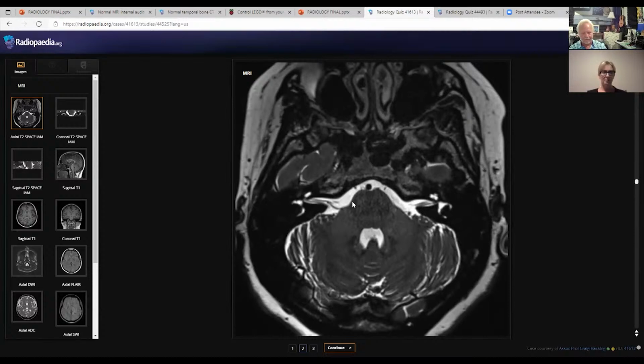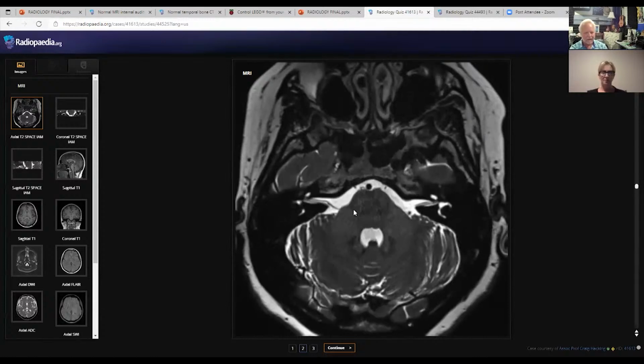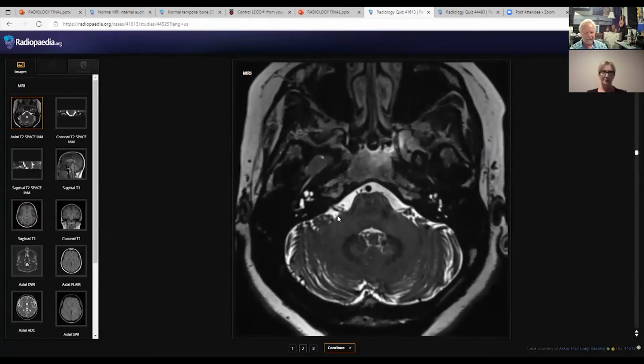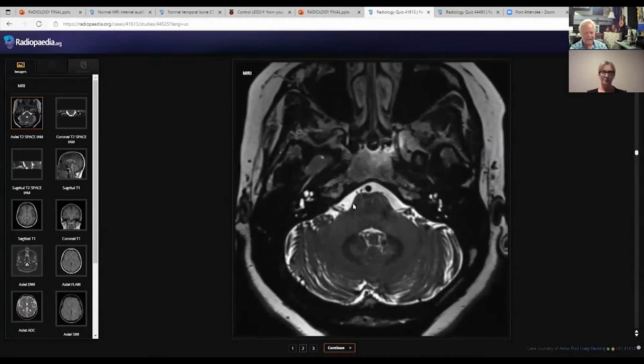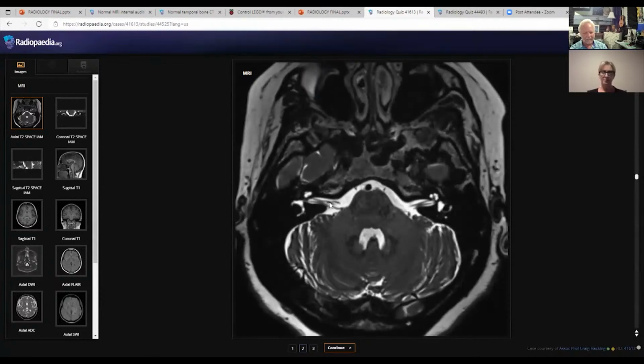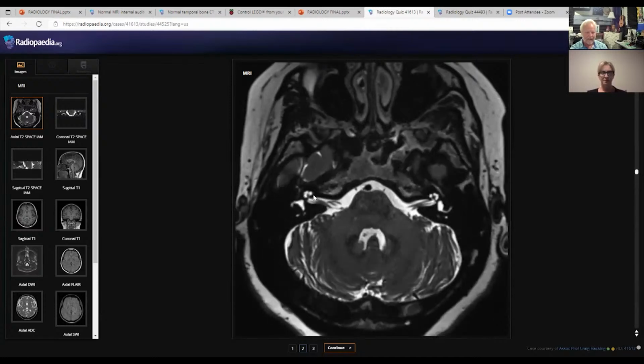And so all the structures that are floating in the spinal fluid silhouette out. You can see here lovely images where the 7/8 nerve complex is leaving the brain at the cerebellopontine angle right here. All this white stuff is fluid, and you're seeing the nerves silhouette. Then they travel out, and here's the cochlea. The cochlea is full of liquid, and the dense hard bone around it creates a very dark signal because it's a lot of calcium, so it just doesn't show up at all. And you can actually see the structures inside the cochlea, because they're not water.